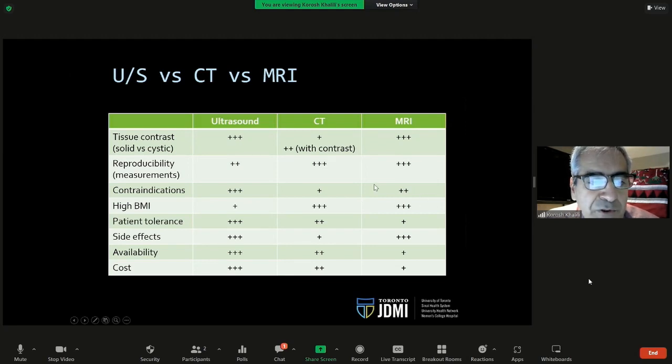So for patients who've had potential problems with kidney function, we may want not to inject the dye. The other issue is that it uses X-rays, which is not good. There is a very, very low risk of developing tumors and cancers from having high doses of radiation from the X-rays.